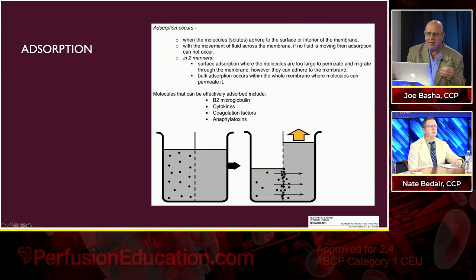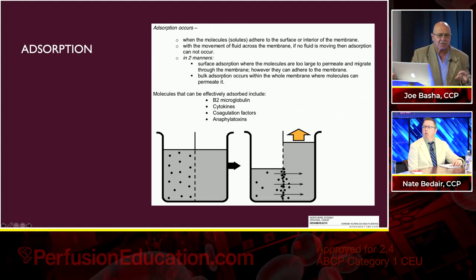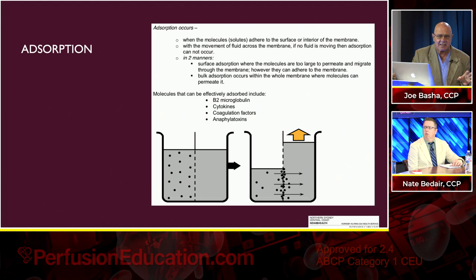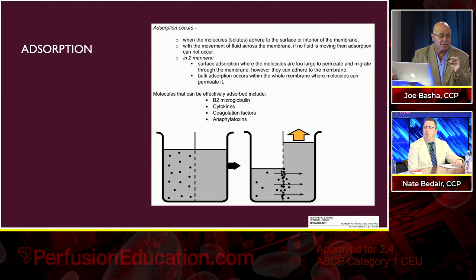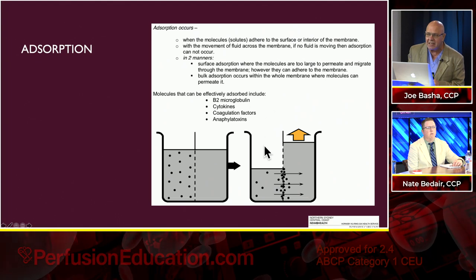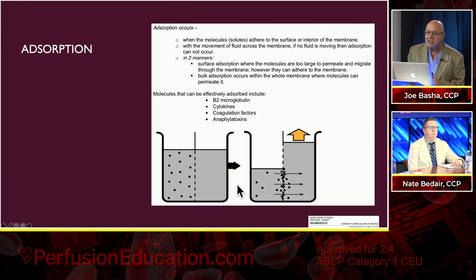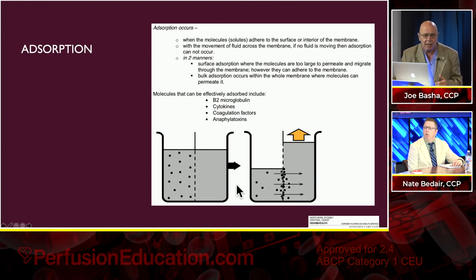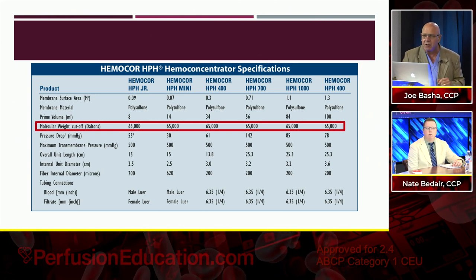And that's really how inflammatory mediators are removed with traditional CVVH, especially when it's not a high pore size filter or there is insufficient ultrafiltrate, lower, like 25 cc's per kilo per hour versus 45 cc's per kilo per hour. As you can imagine, the more force you put here, the more likely it'll force the larger molecules across. But you're still adsorptive. Adsorption is really the more common way that things are removed. And we're going to talk a little bit about the CytoSorb because that's how that works.